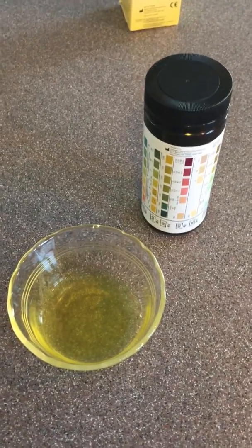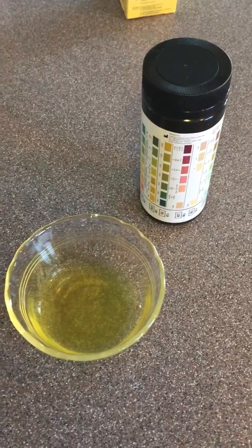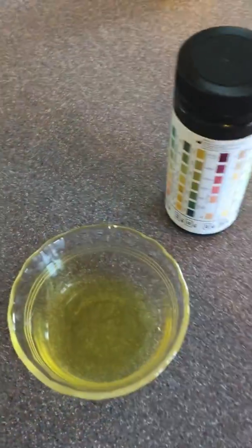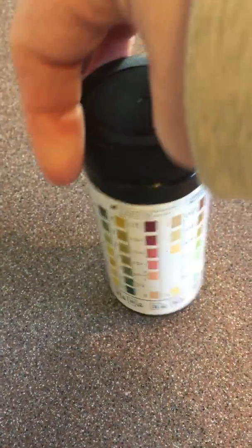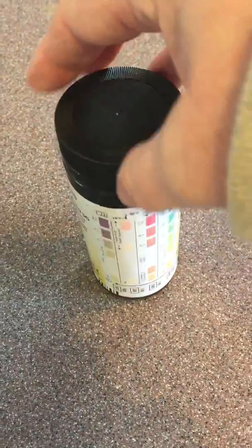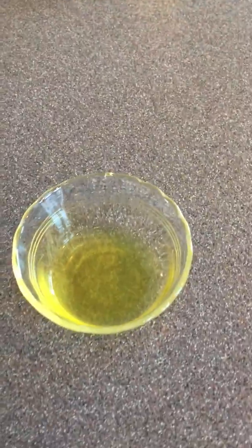So we're back with our urine that we just collected outside, and we're going to do a urinalysis. So we have these marvelous little test strips. They're called 10 SG sticks, and it lets us measure a whole slew of things. So we're gonna measure it out, and we're gonna take one of the sticks. And we're doing this for a couple reasons.